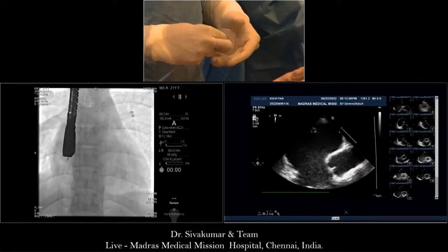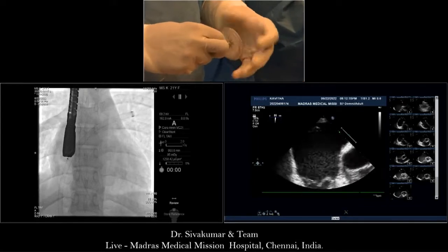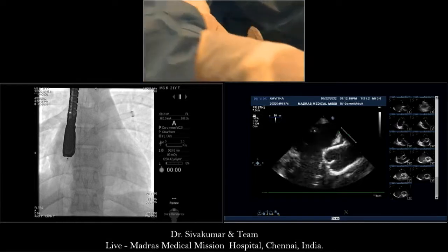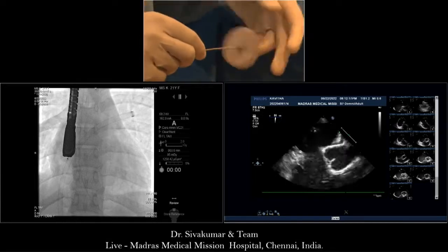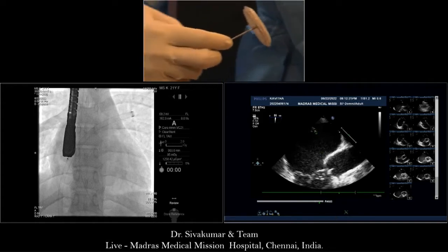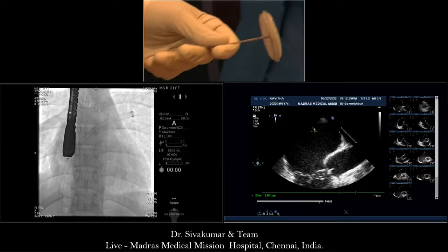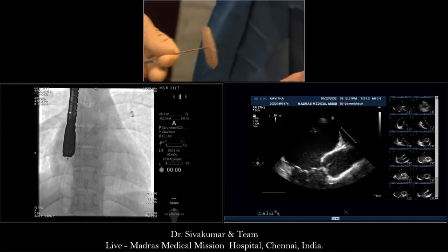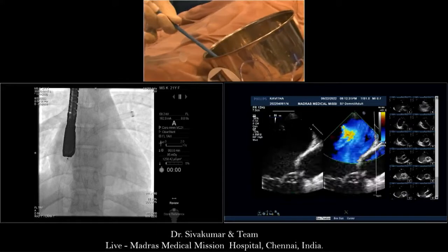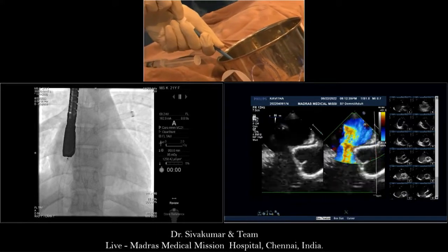27, 31 are the two dimensions we've got. You want a third one? We can't, they can't see it on the bicaval. That's the problem. Did you measure bicaval view? There was no defect on bicaval. Otherwise, after she rotates leftward, there is a... Is this the bald aorta or not? It's around 29. Bald aorta carries a higher risk of erosion. 29 is the measurement here.